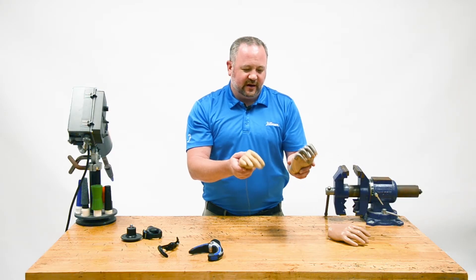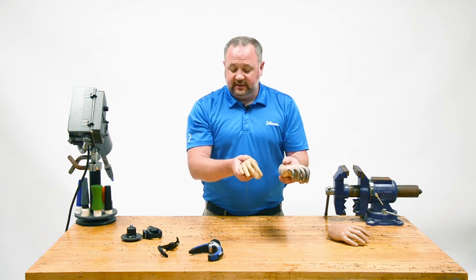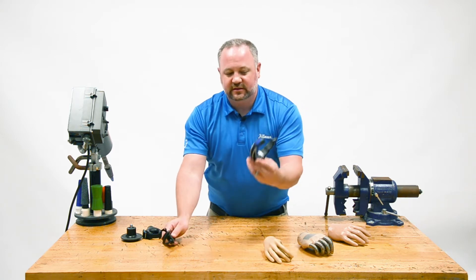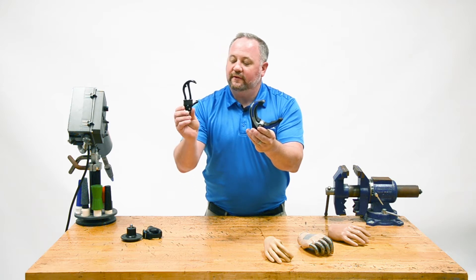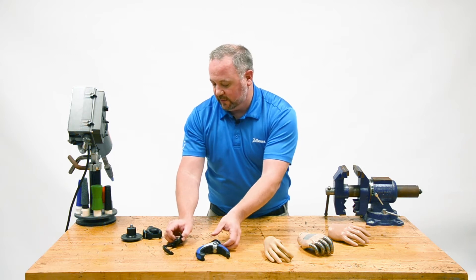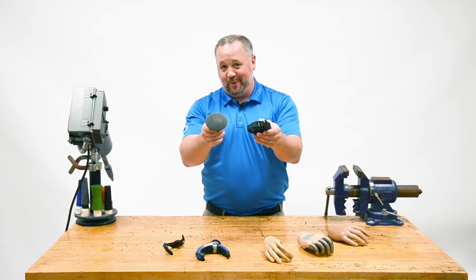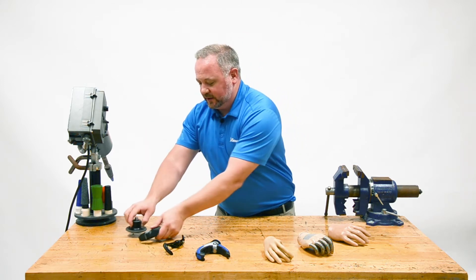These mechanical hand devices unfortunately tend to be very heavy and require a lot more force to operate. These days, especially with patients becoming more comfortable with a more robotic cosmetic look, we tend to choose devices like a voluntary closed type device from our TRS group or a voluntary open hook. Don't forget that there are also a lot of activity-specific devices out there, which we'll cover in a later video.